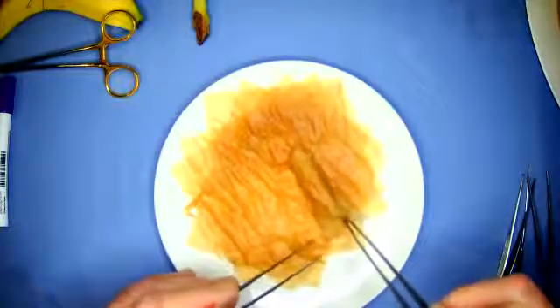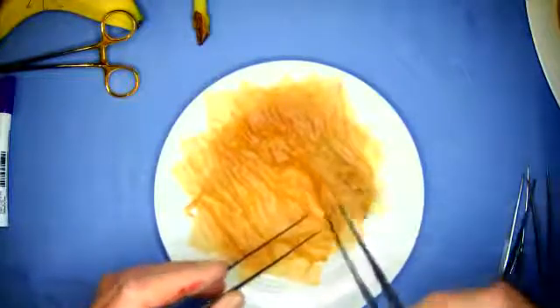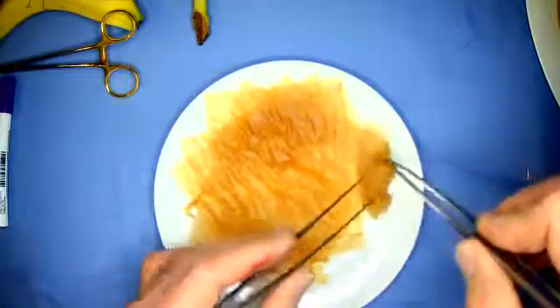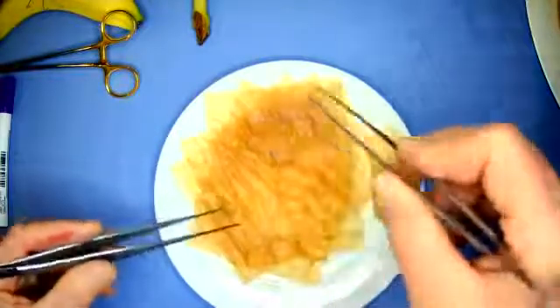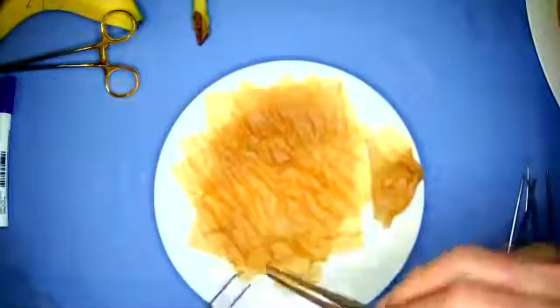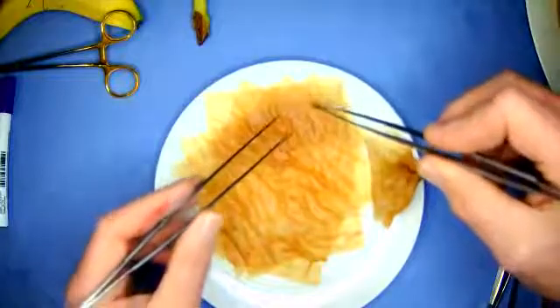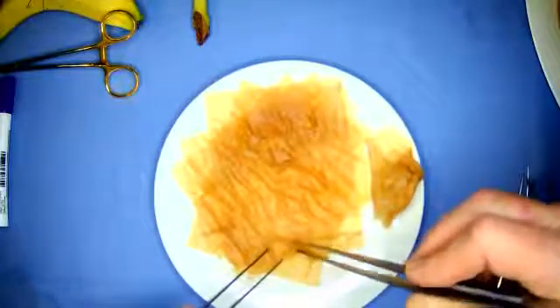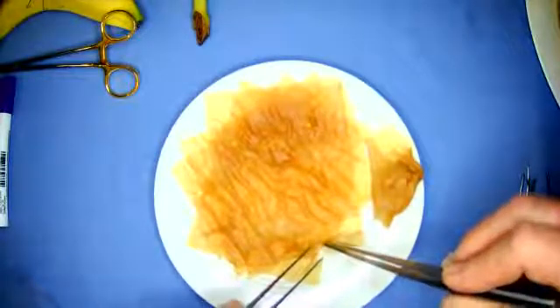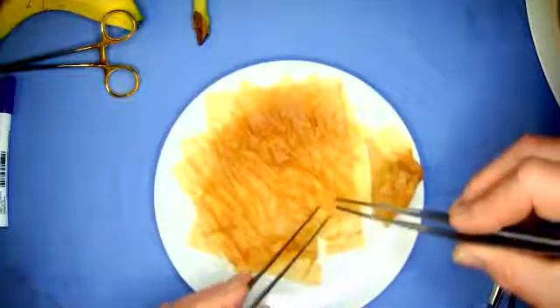Okay? And certainly if you're doing burns dressings or changing dressings or skin grafts, your handling of this tissue is not too dissimilar. Let's take it off and then continue with the model. Where's my next layer? I had 5 layers in here. So let's have a look, shall we? See if I can pick it up at the edge. But underneath, this is now getting quite soggy because it's been here. You can see just catching it has torn it there. But picking up the edge, whoopsie, now it's blotting paper. There you go, there's an edge. And this is how fragile some tissue is.